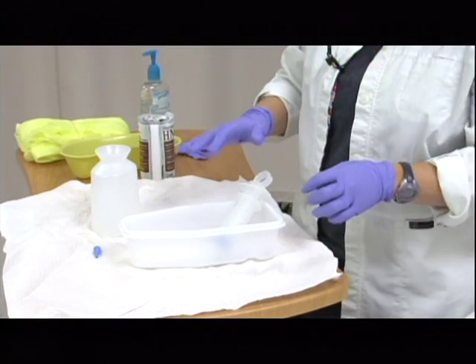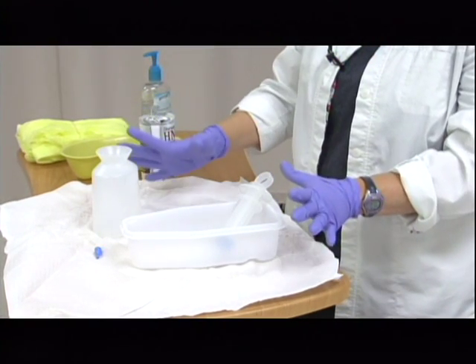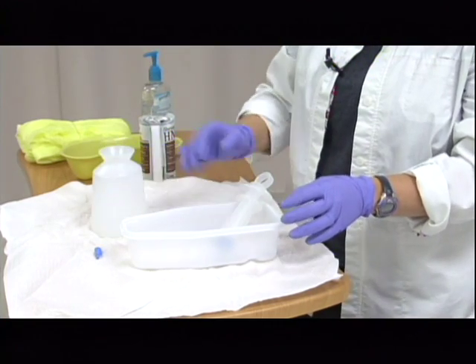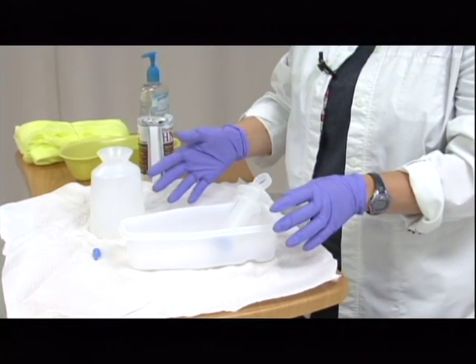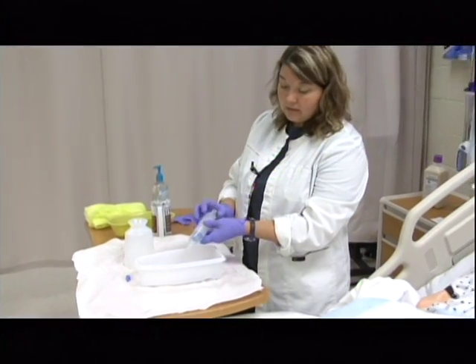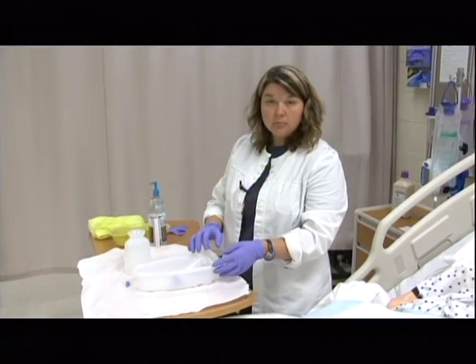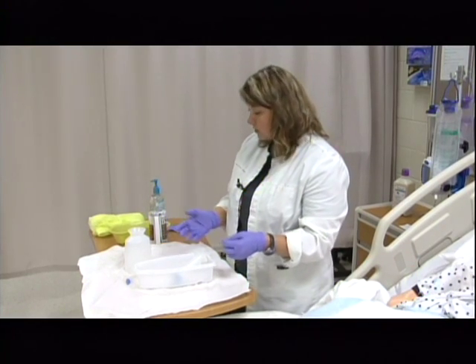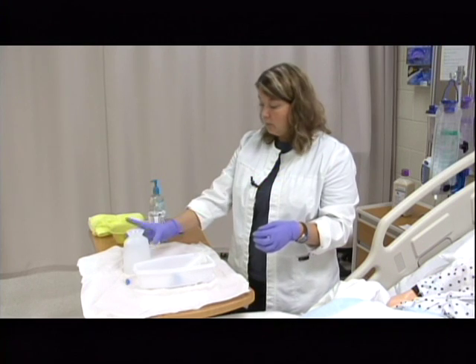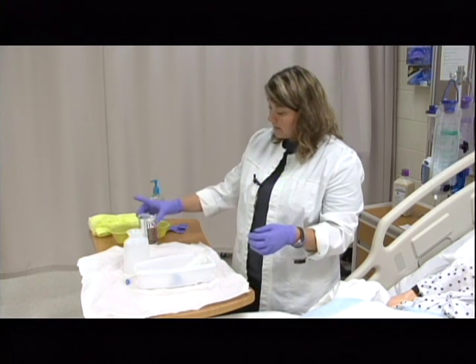Now, this equipment, you need to make sure you look at your facility policy for how often it needs to be changed, but most of the time it needs to be dated and initialed and changed every 24 hours. These things can harbor bacteria, and so you want to make sure that you're keeping up with it so that you don't introduce bacteria to your patient. So I've now got my set opened up. I've added my warm tap water per facility policy. I've got my tube feeding over here.